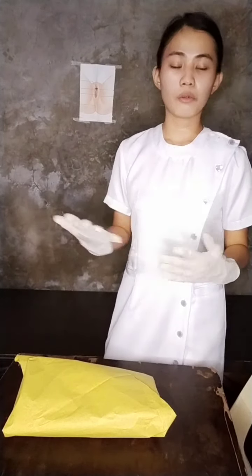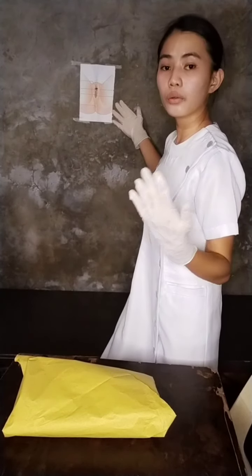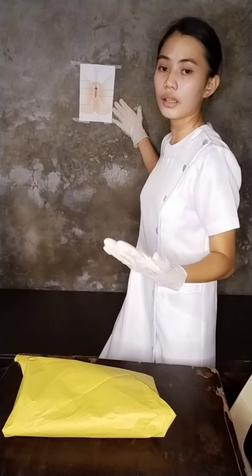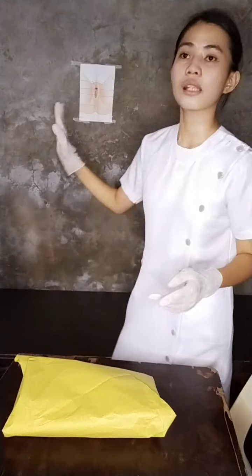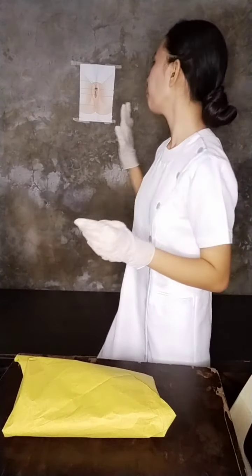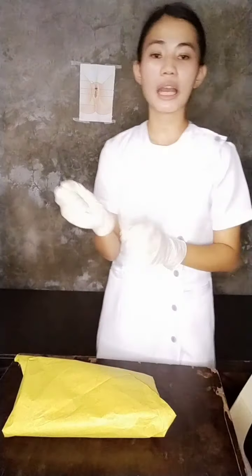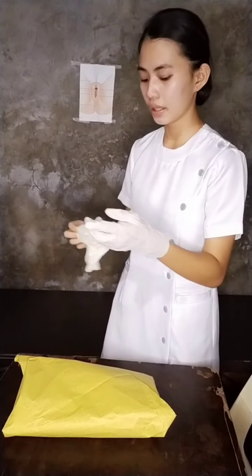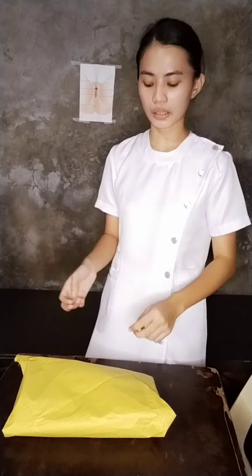Next, you need to place a drape under the buttocks of the patient to avoid spilling of fluid on the bed. And then you need to palpate the symphysis pubis of the patient to check the fullness of her bladder. After that, you can discard the clean gloves and proceed to opening the catheter kit.